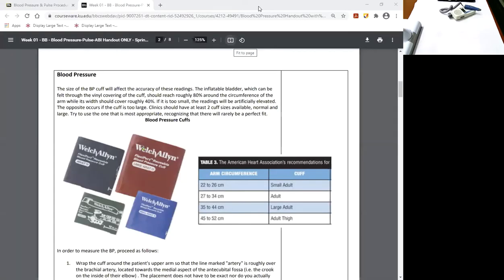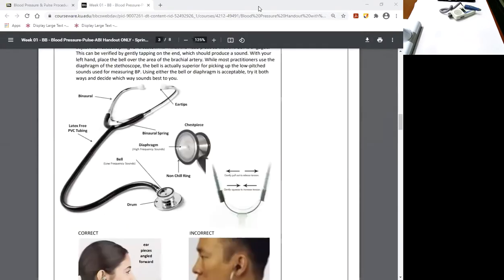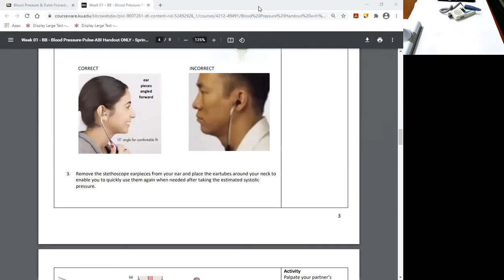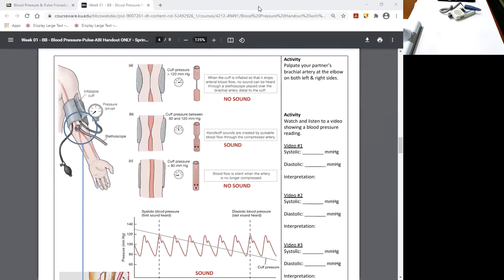Now, we've gone through the pieces. So here's the blood pressure cuff. We talked about that. We've talked about the stethoscope. So now, before we pull it all together, you need to understand about the sounds, what you're listening for and when you should expect to hear it. It's important to understand this, or you won't be able to get the readings correctly. So before Judy comes in, Judy hasn't come quite yet, let's just clarify the two pressures.